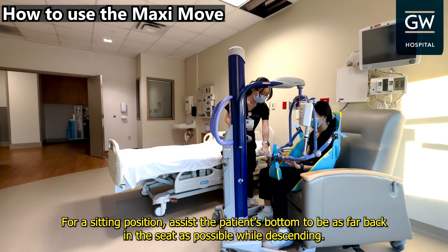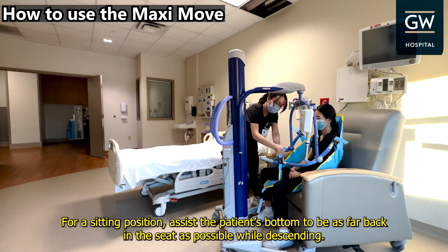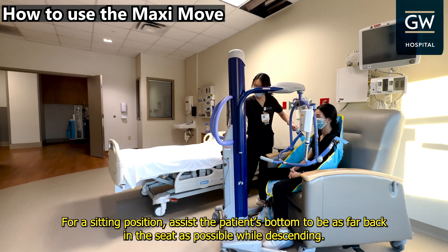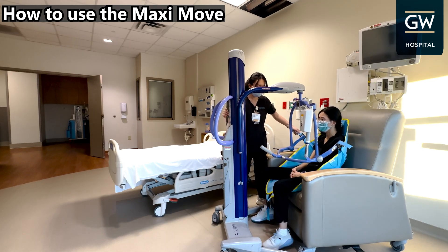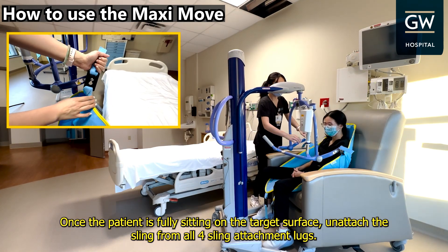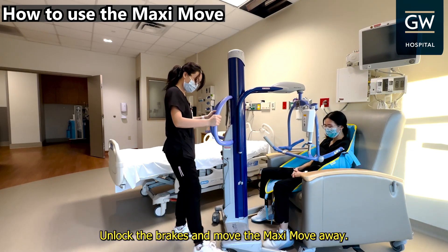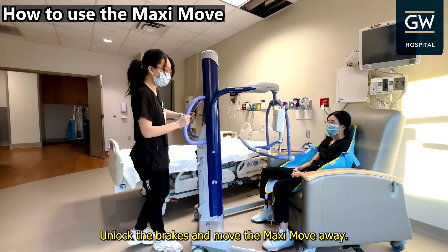For a sitting position, assist the patient's bottom to be as far back in the seat as possible while descending. Once the patient is fully sitting on the target surface, unattach the sling from all four sling attachment lugs. Unlock the brakes and move the MaxiMove away.